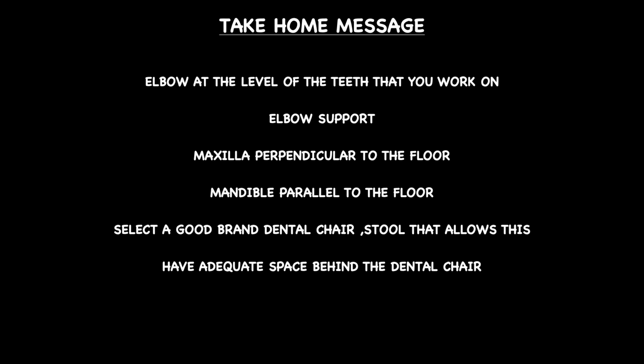And you need to have adequate space behind the dental chair. The common mistake I've seen a lot of beginners make is they install the chair so close to the wall behind that there is no space for the operator to go and work in the 11 or 12 o'clock position with the chair completely in the supine zone, which means it's impossible for an operator to work with proper ergonomics with such a setup. So you really need to reconsider or reorganize your setup, because this is going to have a huge impact in the long term of your dental practice.